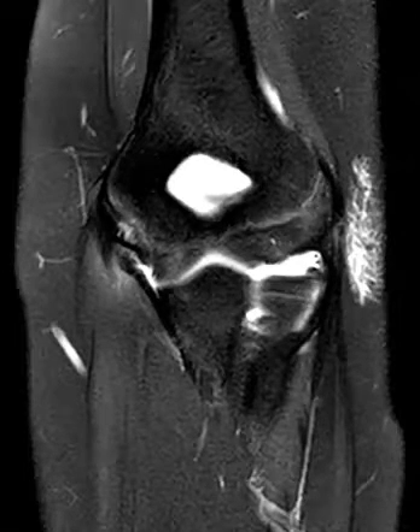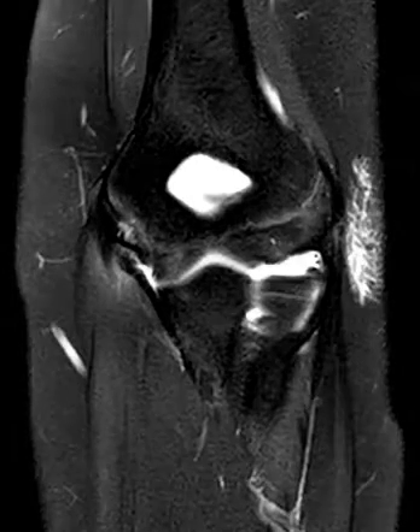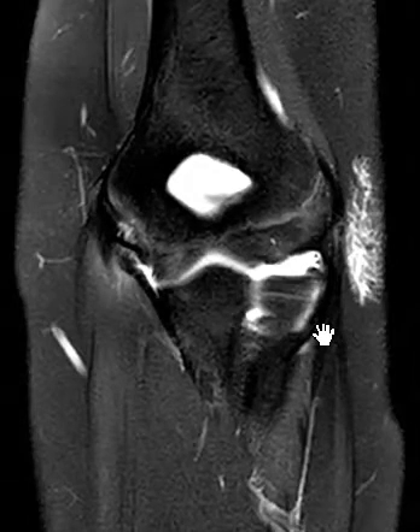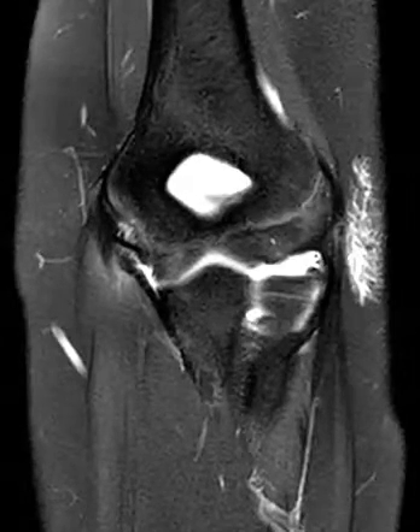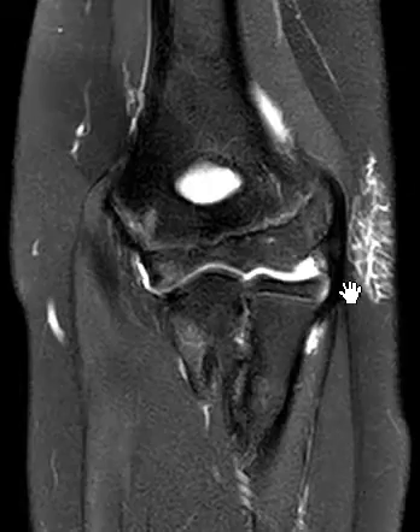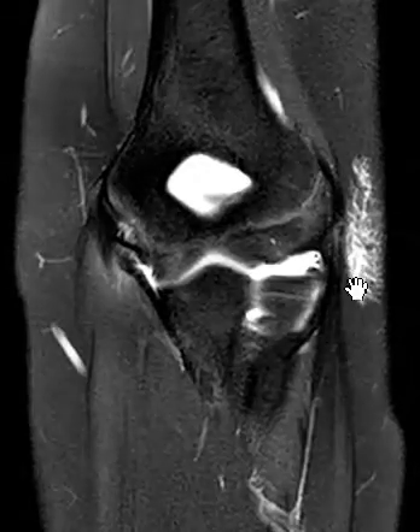Hello, this is Dr. Gay from First Psych MRI. This is a 12-year-old pitcher who's having complaints of pain on the medial aspect of the elbow. The physician thought it was probably a tear of the UCL, the ulnar collateral ligament, and this is just a quick look at an injury of the UCL in this patient.